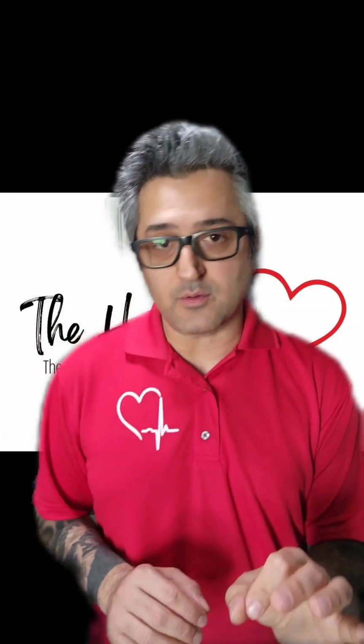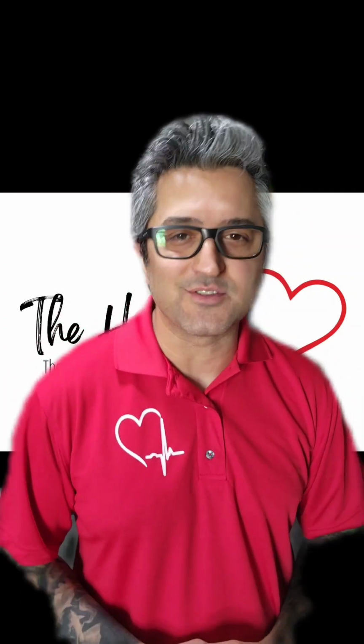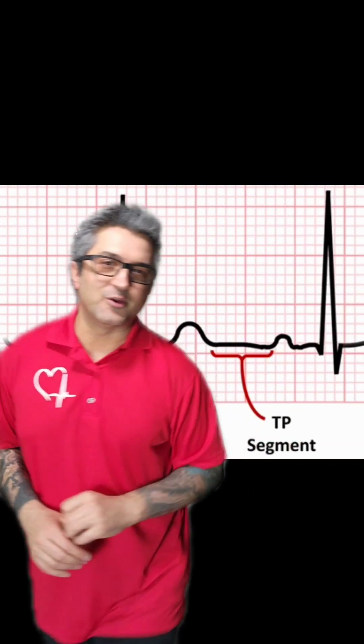And today, let's talk about how to properly assess your ECG for ST segment changes. But first, a quick review.